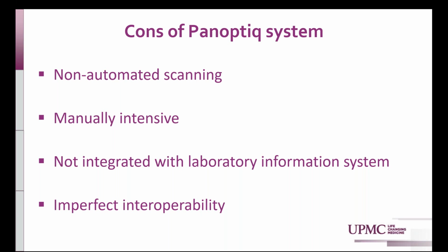However, this does mean a person, whether that be a pathologist, technician, or otherwise, will manually need to scan the slide, maintain proper focusing of the tissue plane, and use the microscope navigation to create the whole slide image. There has been a lab that is attached to the Panoptiq system with an automated slide scanner, but I'm not familiar with how that system had performed.